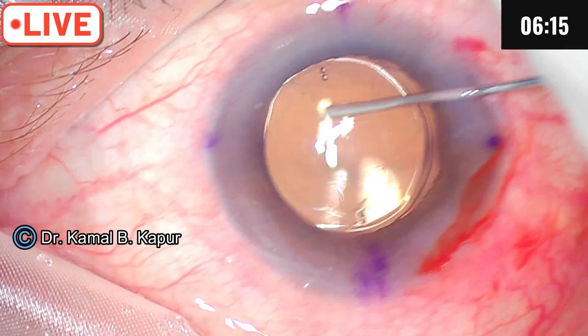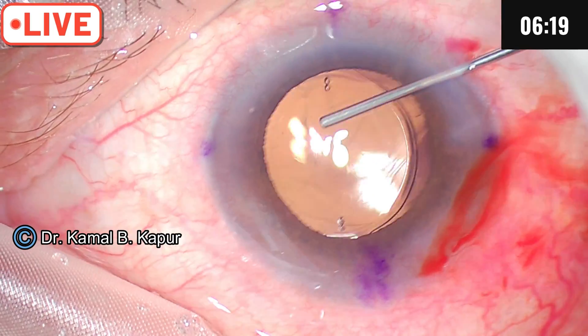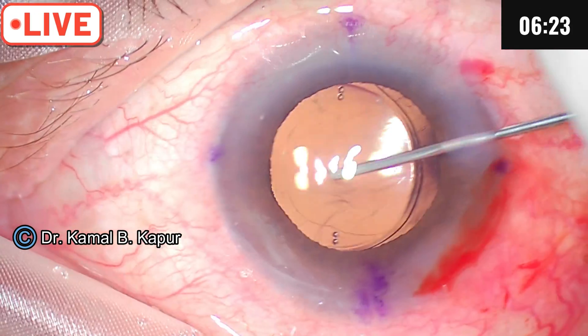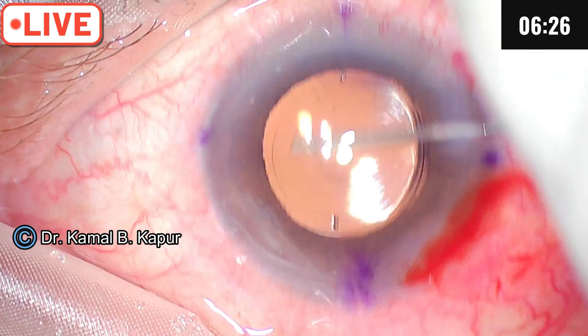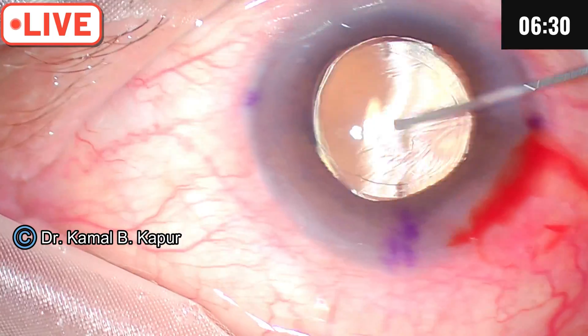We will now do the final irrigation aspiration. The IOL will always have a tendency to rotate clockwise during the hydro procedure, which is why we under-rotate it — so that during final irrigation aspiration, the rotation brings it precisely into position.